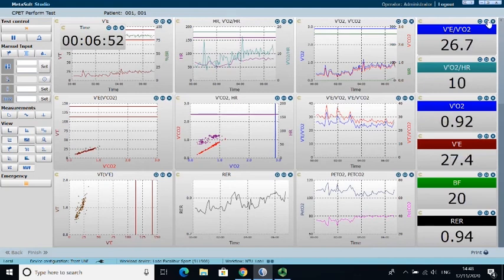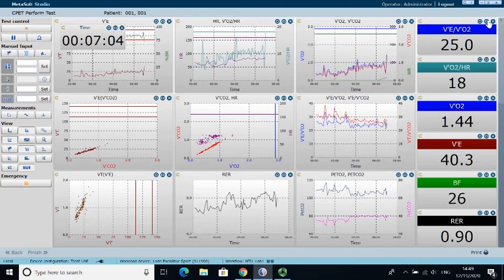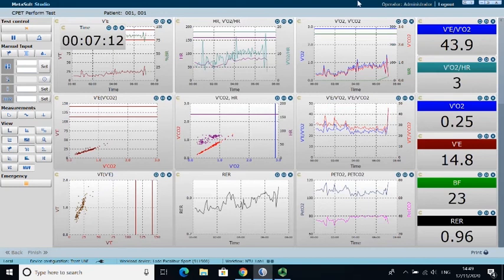What's also quite interesting is if you look at the bottom left hand panel, which is this plot of tidal volume against VE, what we can see is that in order to increase his ventilation, his VE, in this early phase of exercise, he's achieving it largely by increasing his tidal volume, so breathing deeper. That's often what you see when people start exercising. They don't initially start breathing much faster, they just take deeper breaths. And we're going to see how that profile changes a little bit during the exercise.